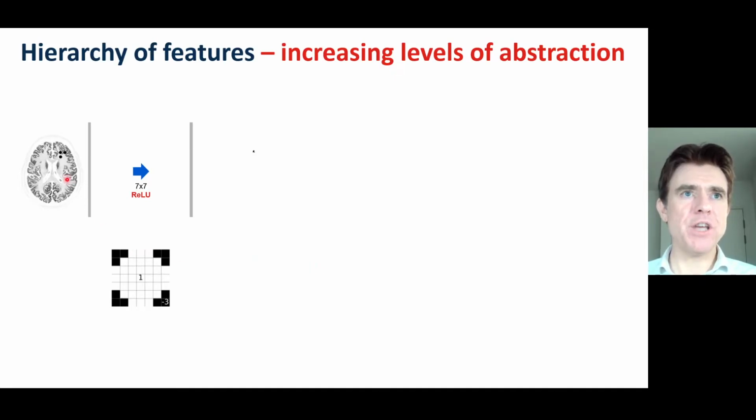Now, imagine if we had 3 such lesions present in the image, then our convolution output would now nicely highlight those 3 lesions. And just to emphasize, this feature map is showing us the spatial location of those features in the image.